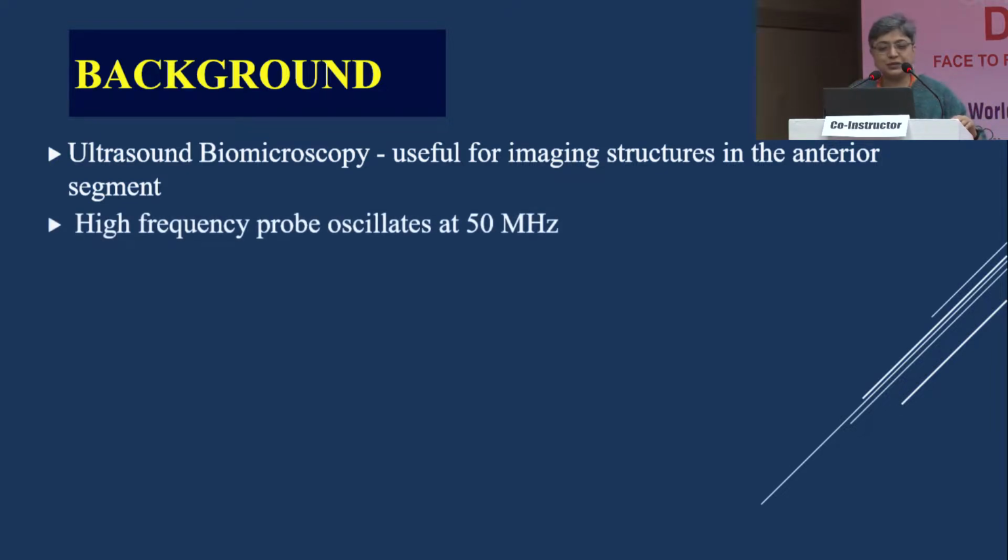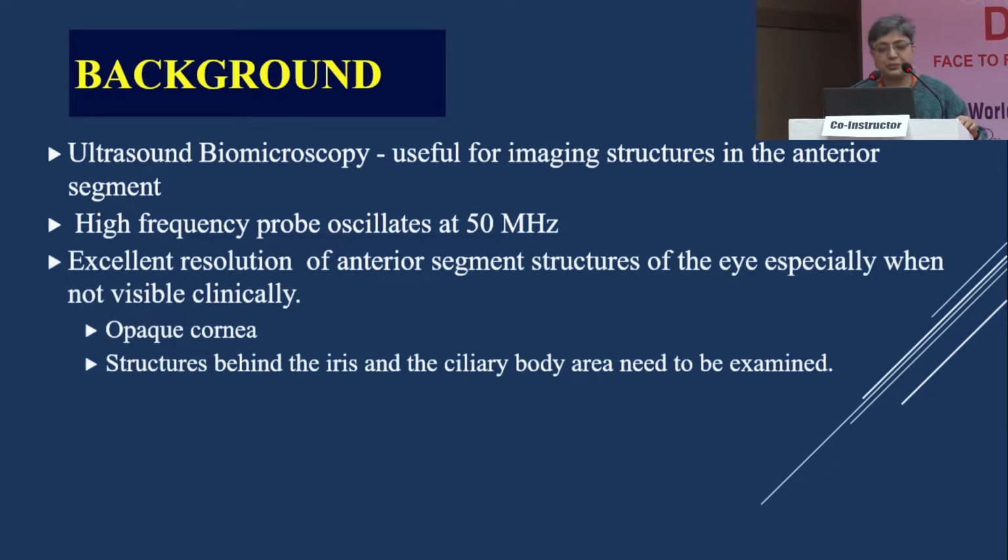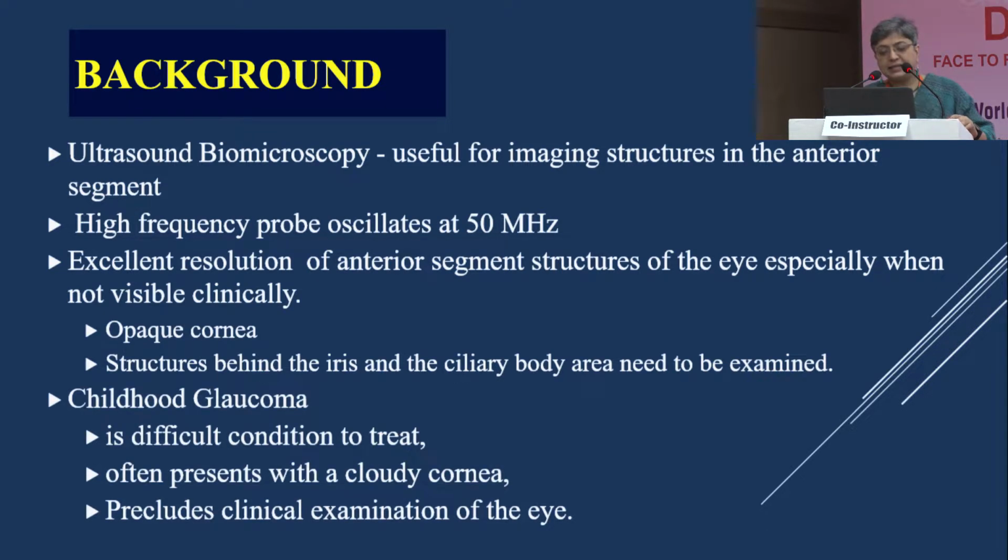So Dr. Pandav has already told us the background of the UBM. And in children, for opaque corneas and structures behind the iris and ciliary body area, when you need to examine them, this really is the only investigation tool that you would have. And it's a condition which is difficult to treat, often presents with a cloudy cornea, and precludes the usual clinical examination of an eye which we do.